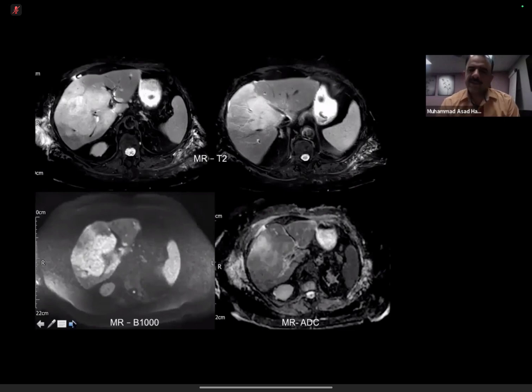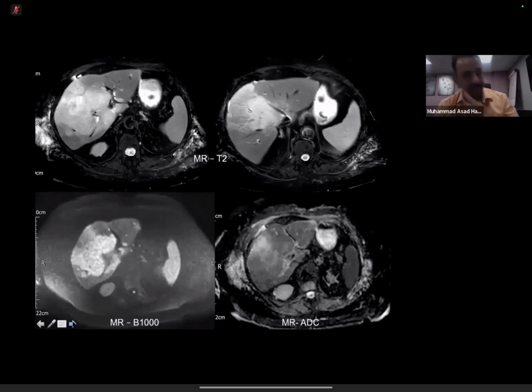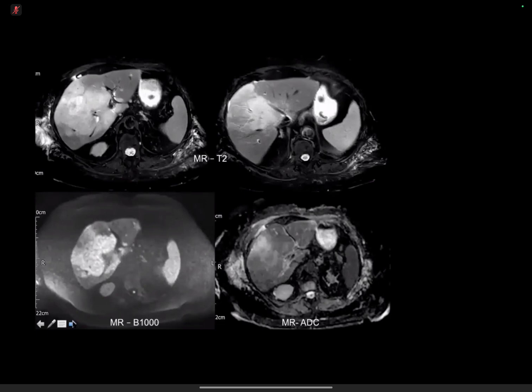Now, can you describe the technique of liver biopsy, how the liver biopsy is performed? Yeah, so it's performed under ultrasound guidance. Good. And obviously, pre-biopsy checks, as you mentioned earlier, normal blood checks, PT, platelets, hemoglobin level, cross-matching, all these need to be done.